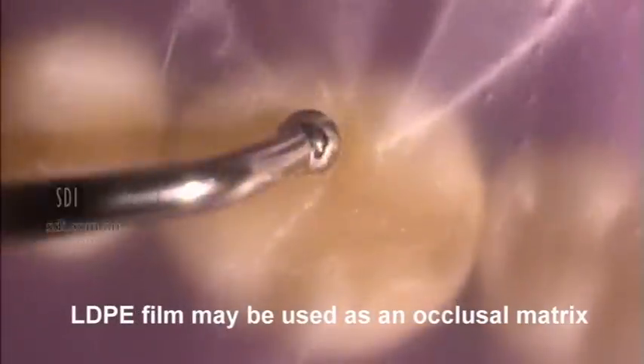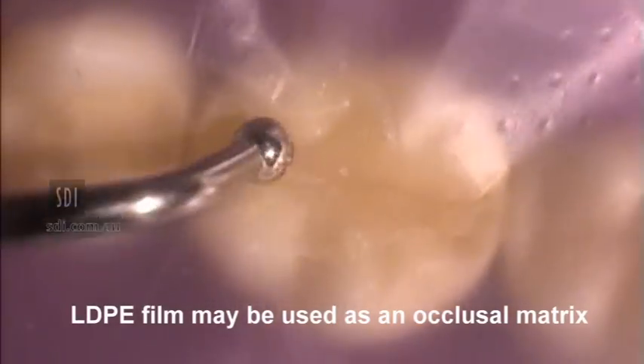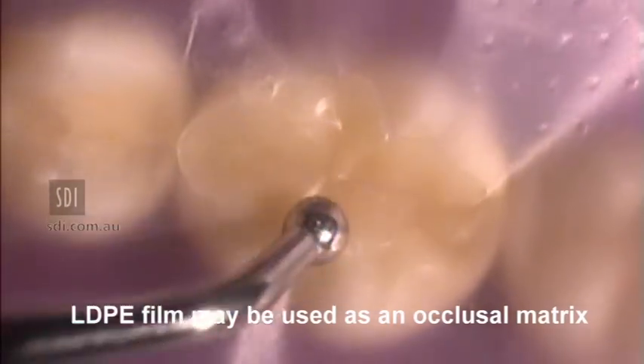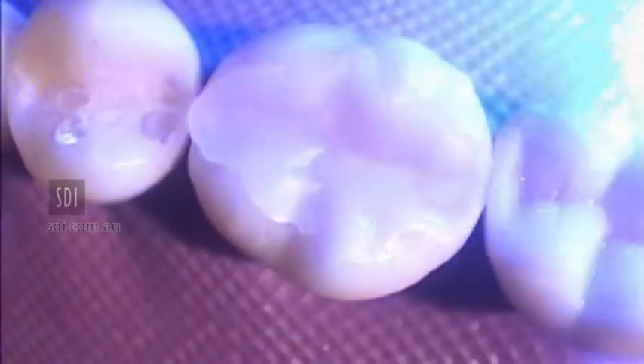Condensation may be facilitated by placing a plastic film over the preparation and continue condensing. Or if not using rubber dam, use the film as an occlusal matrix. Light cure the restoration for 10 seconds. Remove the plastic film and photo cure for a further 10 seconds.